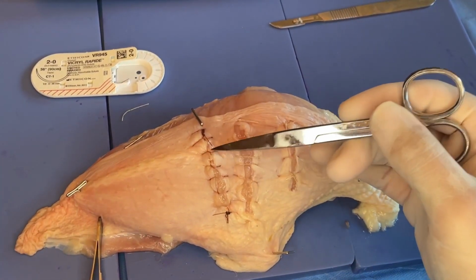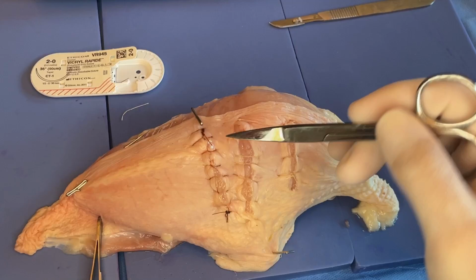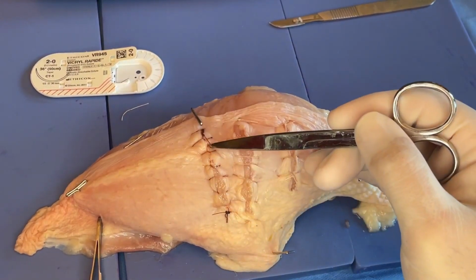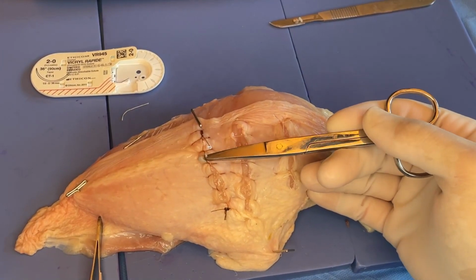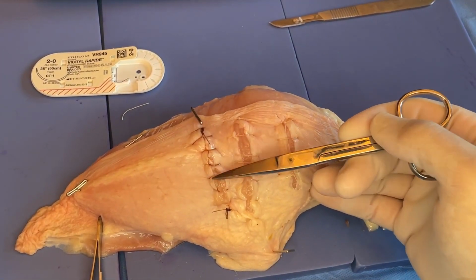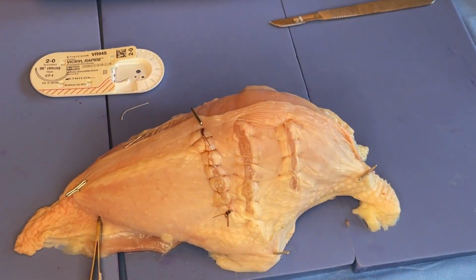And again, you can see that we've got not only this lateral compression because of our looping through the tissue, but because of our locking area here, which you can see this little piece that goes from loop to loop to loop all the way down, we get that longitudinal compression.